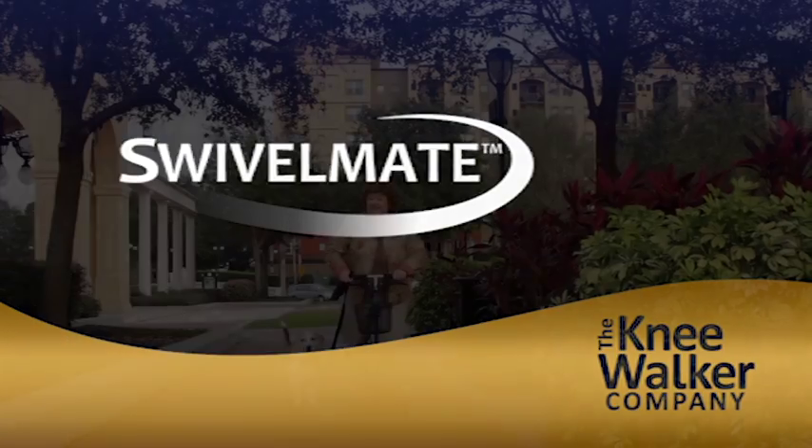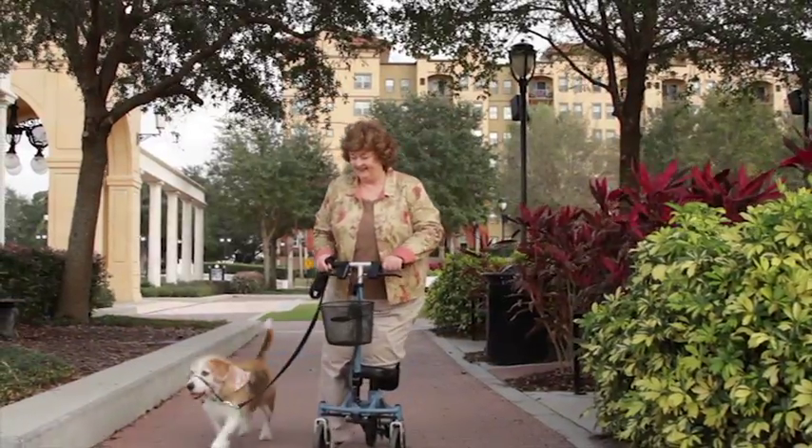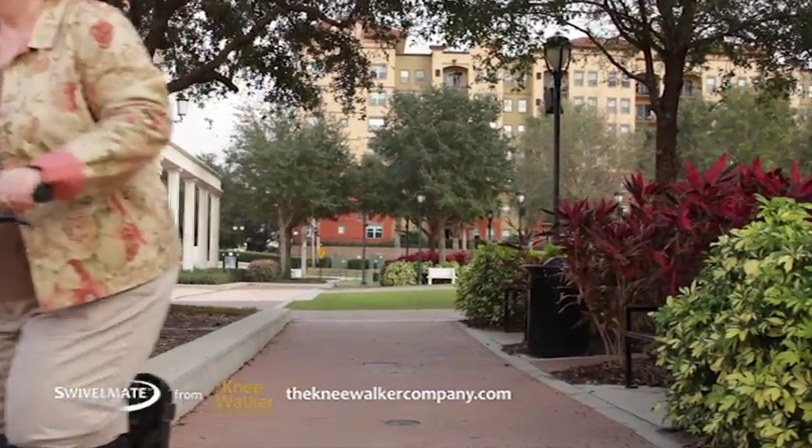Introducing the new Swivelmate by The Knee Walker Company — a new brand of knee walker that makes recovery easier right from the start.